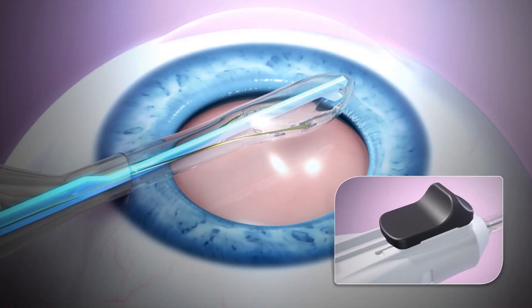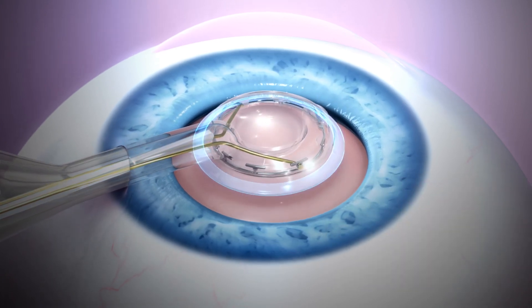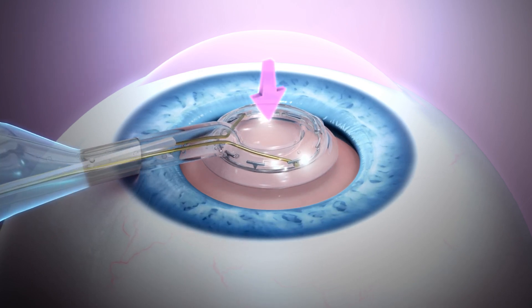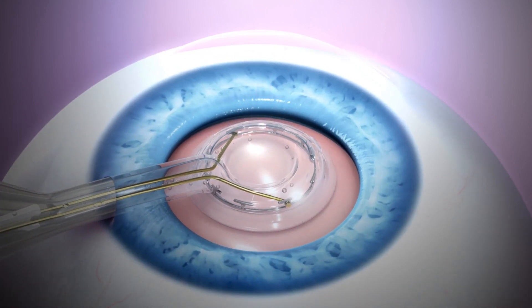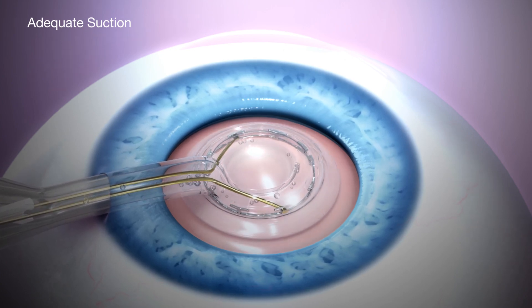The pushrod is retracted to a position just outside the ring and the Zepto tip recircularizes. As suction is applied, the pushrod is retracted to the wide portion of the Zepto neck, allowing the suction cup to drop vertically onto the capsule. Capsule apposition is essential for the development of adequate suction needed for a complete capsulotomy.